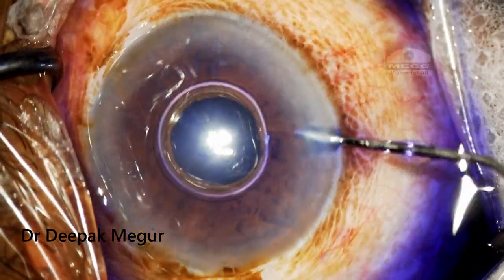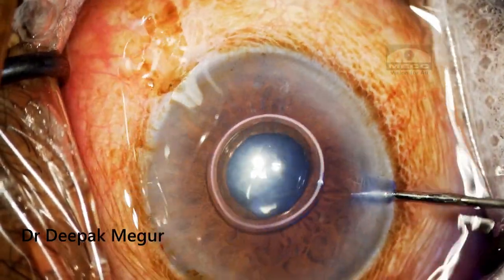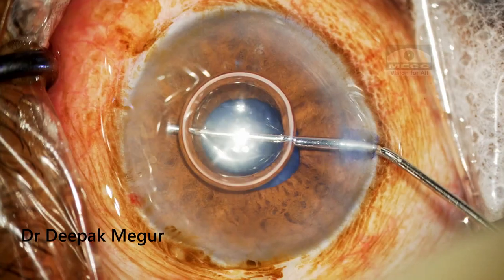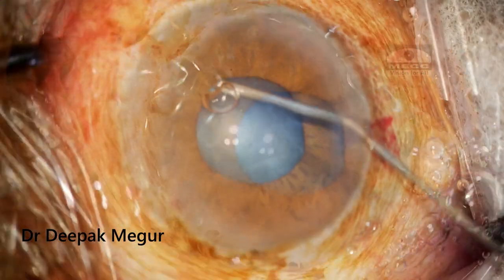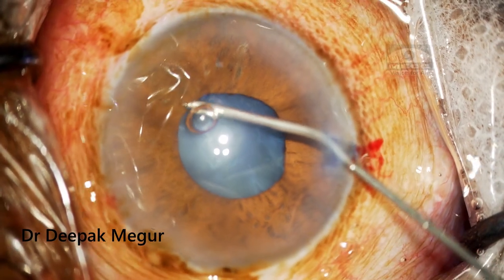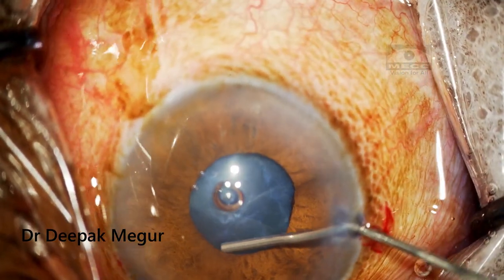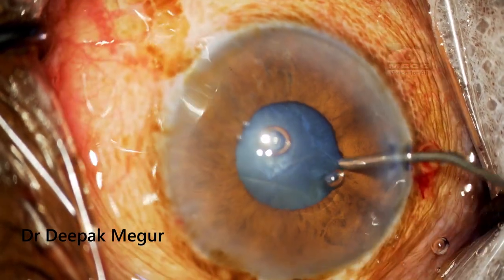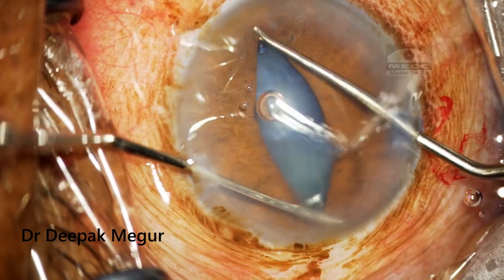Once I have done that maneuver, I am washing the Trypan Blue with BSS and then using dispersive OVD in the anterior chamber under the cornea to protect the endothelium. I am also using a little bit of this OVD under the pupillary margin — it tents up the iris a little bit so that it is easier to perform the stretch pupilloplasty without touching the anterior capsule.